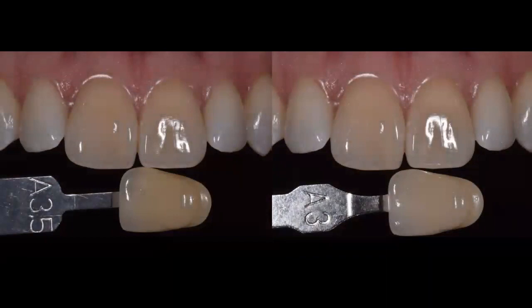And this is us shade matching, where we were before we started. Maybe 9 was an A3 and maybe 8 was an A3.5. We were in the middle of both. We were not sure, but at least we had something to show the patient so she knew ahead of time what our starting point was. For me, this photo is crucial for good documentation, so you can show the patient the progression, because it's hard for a patient to visualize the real changes happening in her smile when treatment takes such a long time.